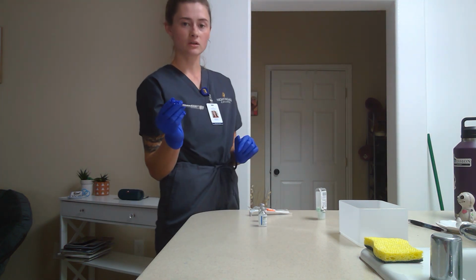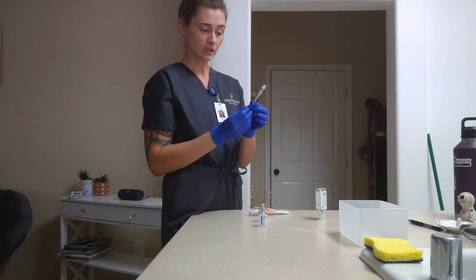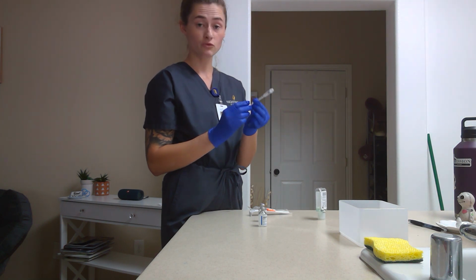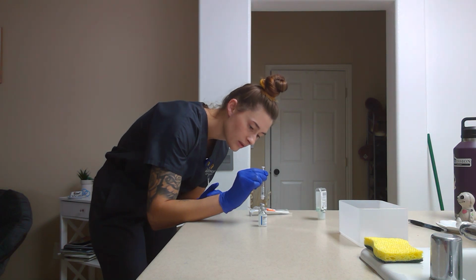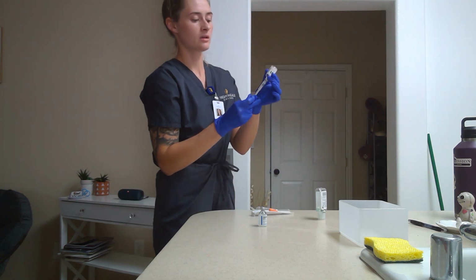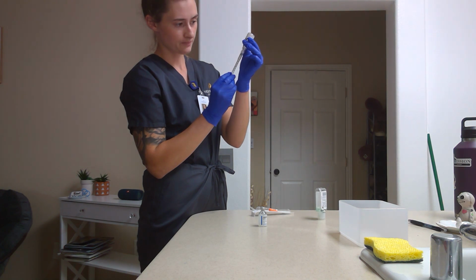And with the same needle, now I'm also going to be drawing back 4 units of air, because I'll be giving 4 units of the regular insulin, and then I will inject the 4 units of air into the regular insulin. And now I'm going to tip my vial and I'm going to draw back 4 units.